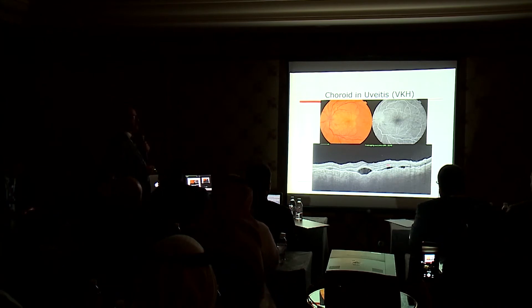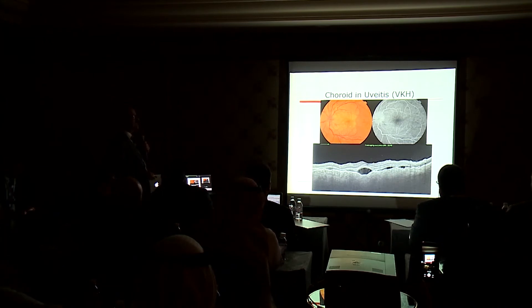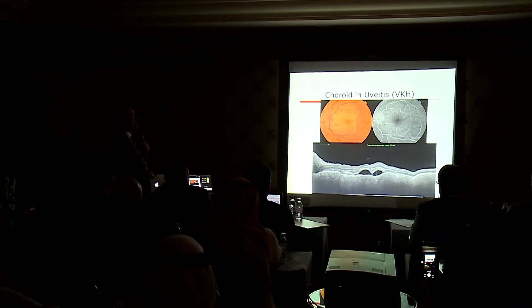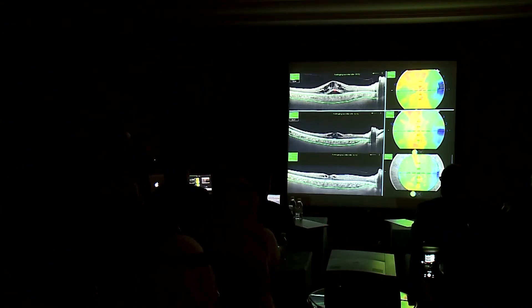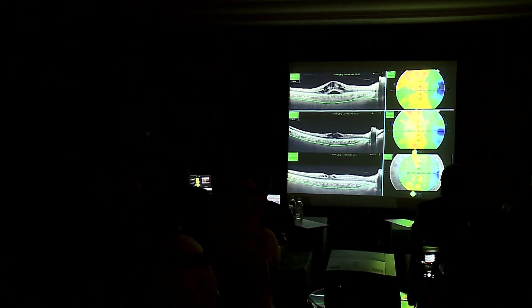In Harada disease, there are multifocal choroidal inflammatory lesions pushing the retina with sensory detachment. We used to follow up only the macular edema, but nowadays we can follow up the choroidal thickening and taper steroids depending on the choroidal thickening, not on the retinal thickening.